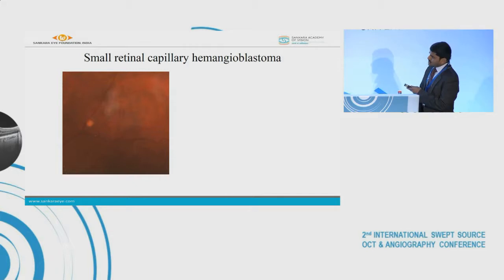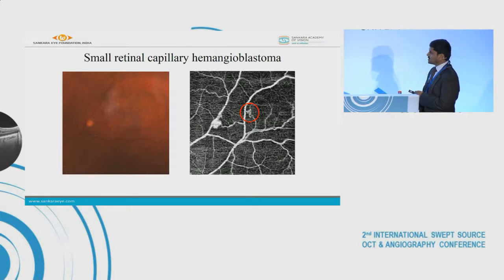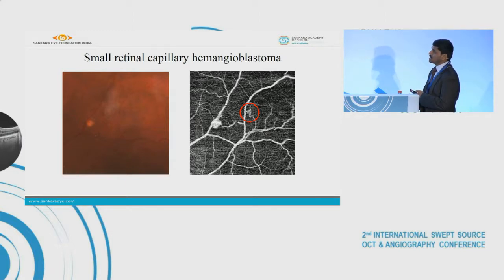In this fundus photograph we can see a small retinal capillary hemangioblastoma but we can't see any feeder vessel. However, when we perform OCTA it does show a feeder vessel — and not just the feeder vessel to this tumor, but also a small tumor which was missed on color photograph and even on clinical examination.